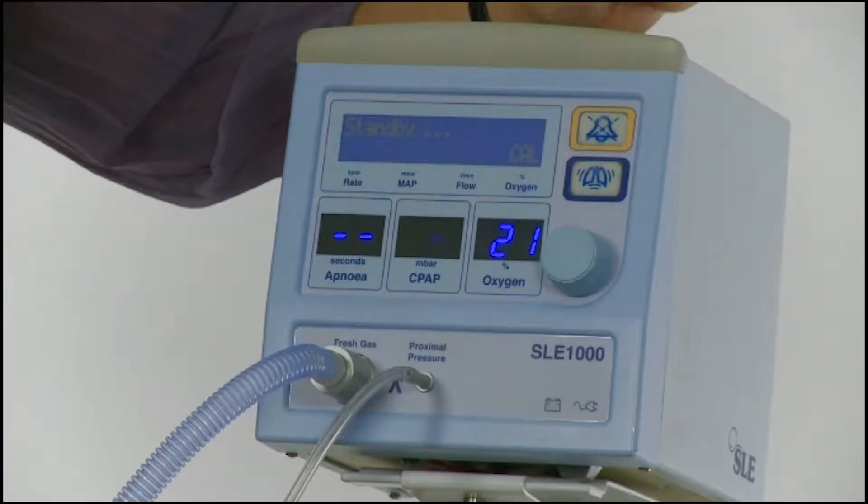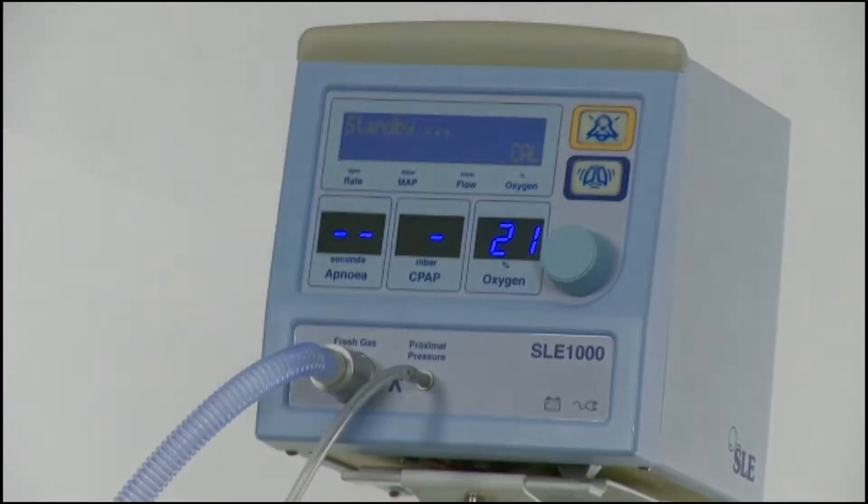When the 21% calibration is complete, CAL will switch to SHOW CAL in small letters. This indicates that the 100% oxygen calibration is being done. During this time, the oxygen percentage, the CPAP level and the apnea time can be set or changed, but the oxygen value will not be displayed until the end of the 100% calibration.